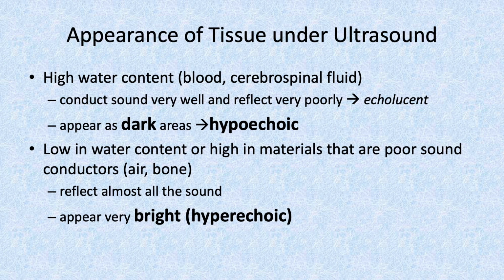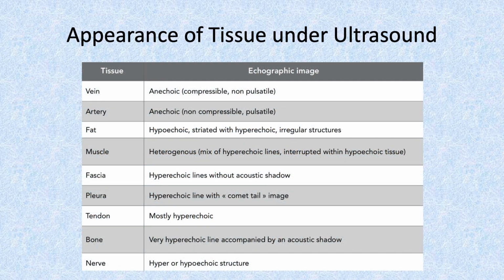But if the water content is very low, like air or bone, then they reflect all the sound, so it appears very bright on the screen. We term this hyperechoic. We utilize these features to understand how certain structures form and how they look on ultrasound.